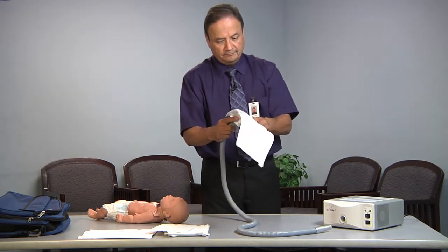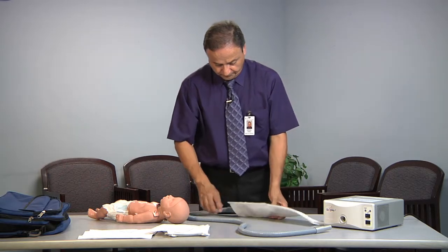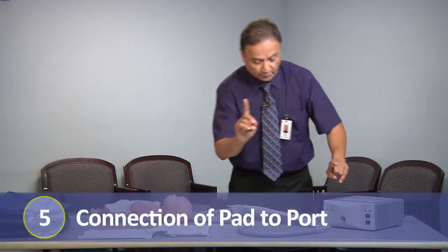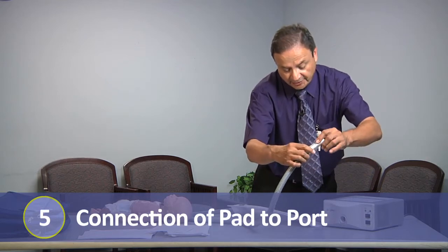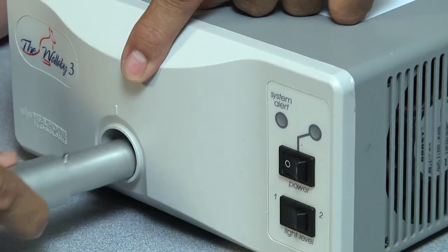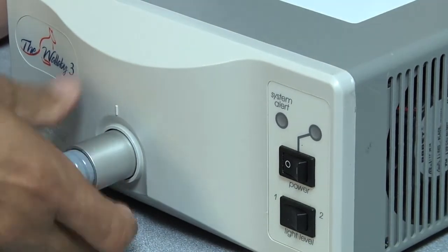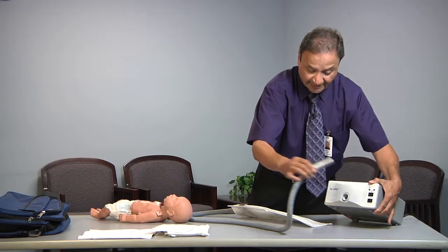There. So you can still see the pad. We slide it all the way through. And then we're going to put the fiber optic cable into the machine. And you see this little latch right here. This actually lines up with this little part here. So we're going to slide it in like this. This one actually turns and it stays in. But if it comes out, it's only going to come out at that time.